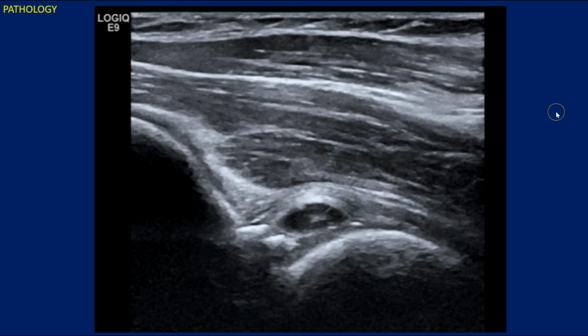In addition to MR and CTA, ultrasound can show labral tear. Here's a young endurance athlete with progressive anterior hip pain. The ultrasound exam demonstrates a few characteristic findings of labral tear. Number 1, a paralabral cyst collecting immediately adjacent to a region of labral calcification. Number 2, heterogeneity of the acetabular labrum.